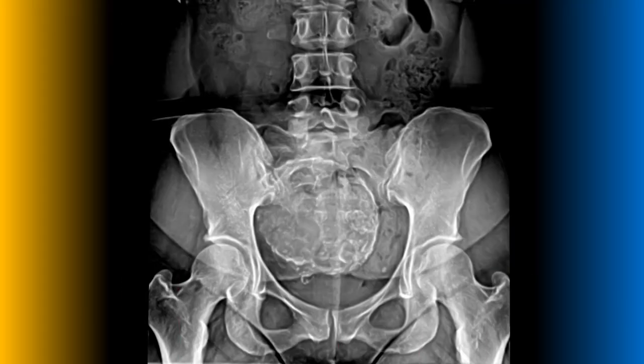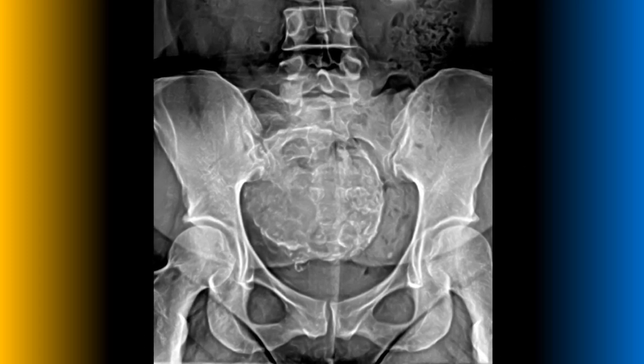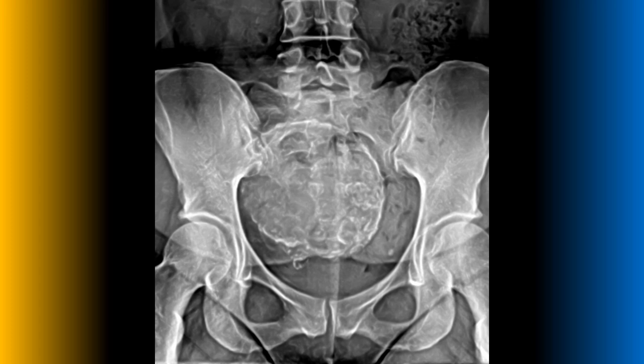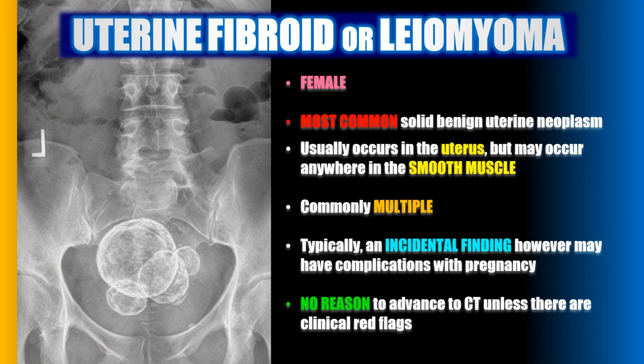Here is an example of one of the most common mass-like soft tissue calcifications seen in the pelvic basin. As long as it's not arising from the adjacent sacrum, odds are this large heterogeneous calcification represents a benign uterine fibroid or leiomyoma. I have a full video on this topic with numerous examples.